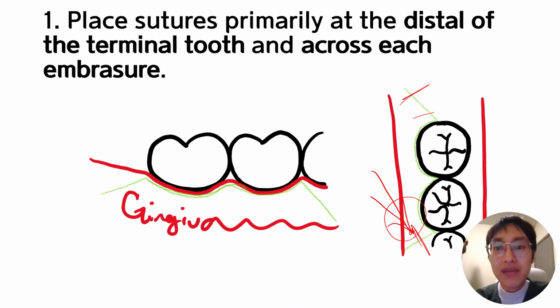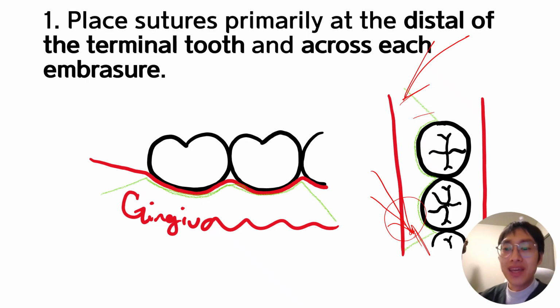But if you end up doing the last knots at the end, then the assistant will have a more difficult time. If you want your assistant to suffer, then it doesn't matter. But why would you make your assistant and yourself suffer during the suture time?